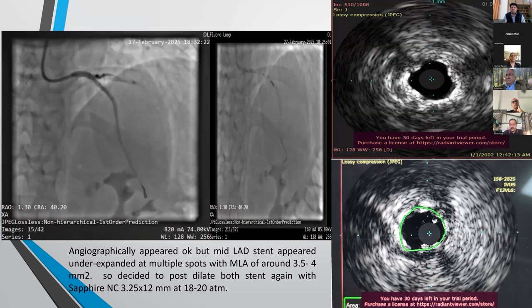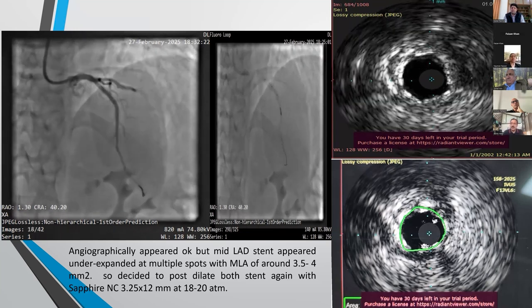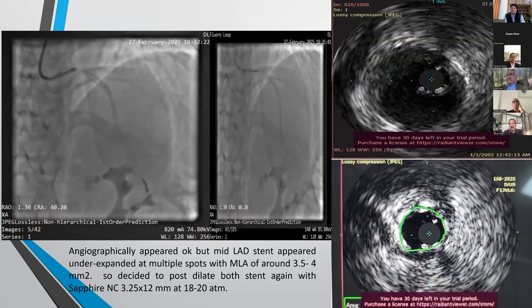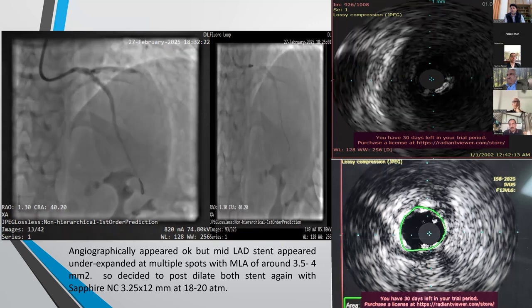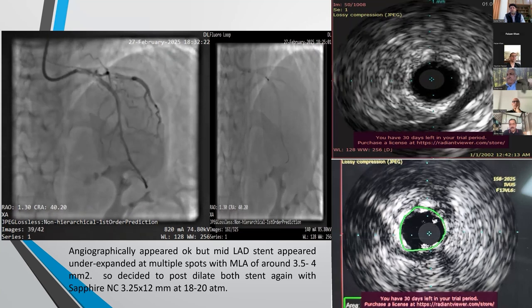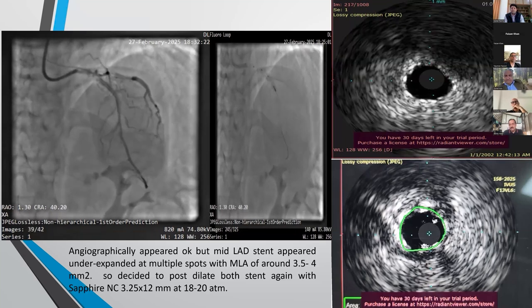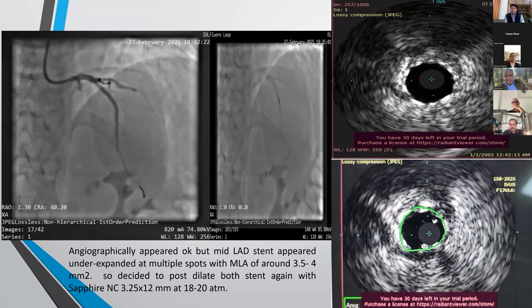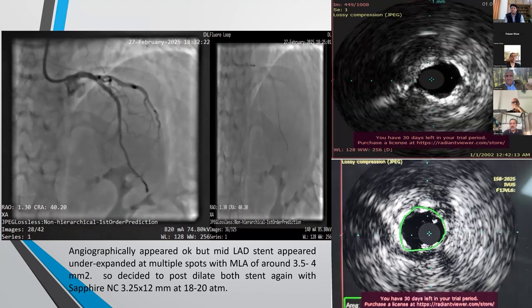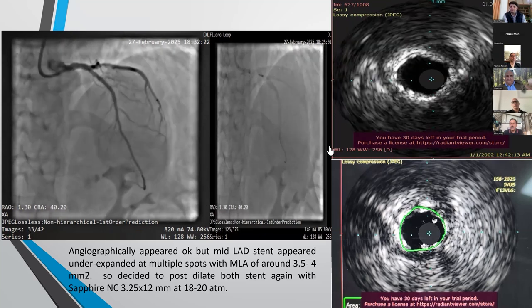As I said, with equalization or zeroing and those kinds of issues, if there is a problem with the wire, it won't zero or equalize. So we did not have a problem. Again, there is a paper from India on reuse guidelines, and they have been using reuse even for tubular structures, especially PTMC balloons. A lot of our government institutions, and sometimes rarely we ourselves, use the PTMC balloon again because of the cost issues.